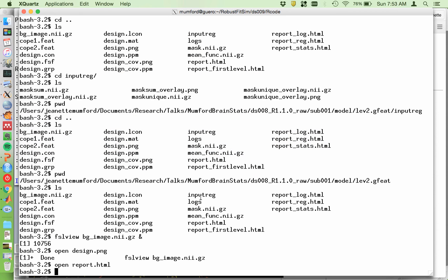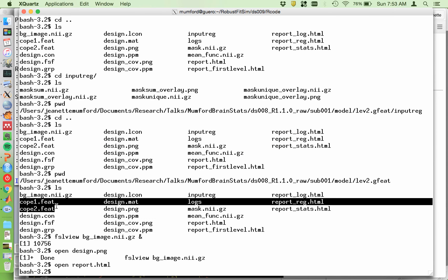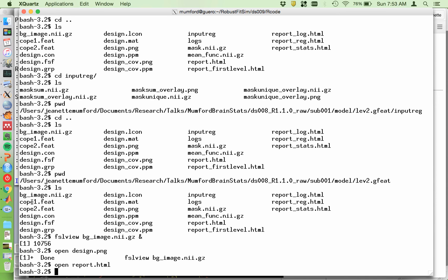Let's go back to the FEAT directory. Here's where people get confused — you'll see I have two FEAT directories here: cope1.feat and cope2.feat. The numbers here don't correspond to this level's analysis because for this one I just ran a one-sample t-test with a single contrast of one. These numbers refer to the lower-level copes that I input into this analysis. The numbers on the FEAT directories correspond to the contrasts that were fed into this analysis — the dependent variable.